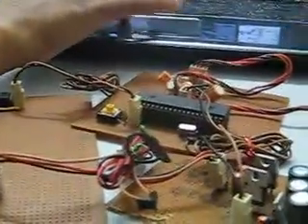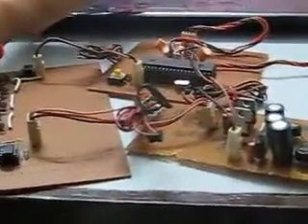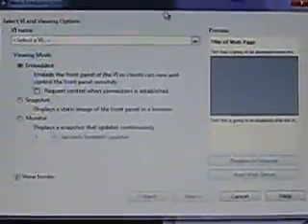Now, the main other feature of our project is that using this we can send this VI format to the doctor directly using the internet facility. For that, first we have to go to whatever VI we want to send to the doctor, go to the VI's front panel. In that we have to go to Tools, and then select the Web Publishing Tool. In that we will get this type of dialog box, and then we have to select the VI we want to send to the doctor.